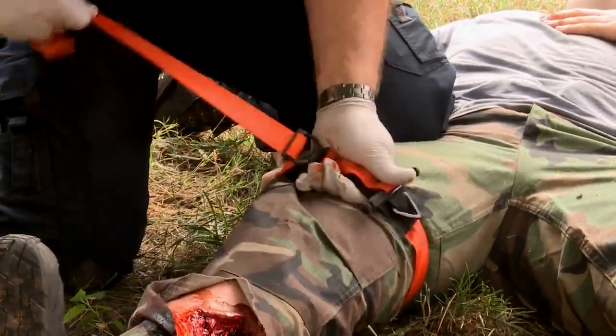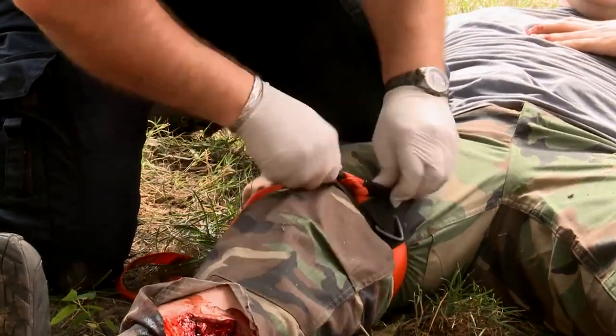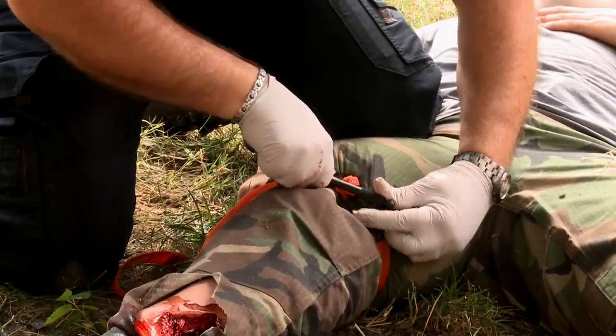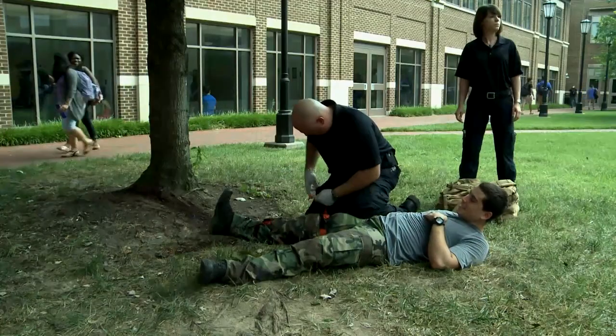Tourniquets are used to control life-threatening bleeding to arms and legs. They should be placed as high on the extremity as possible and tightened enough to stop all blood flow from wounds to the extremity. You should be familiar with the four most common commercial tourniquets available and know how to create an improvised tourniquet.